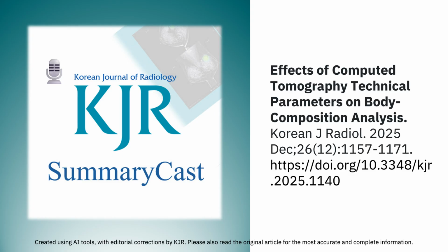And what about the newest technology, photon counting CT? PCCT offers even better energy separation, which should, in theory, lead to more accurate material decomposition and better VNC images. However, the research is very new, and the results for muscle have been inconsistent. Some studies report higher attenuation in TNC than VNC, others report lower. The methods are still being worked out. So this review paints a pretty daunting picture of variability. What's the way forward? How do we make CT-based BCA more reliable?